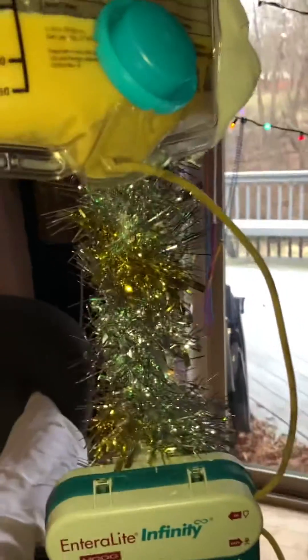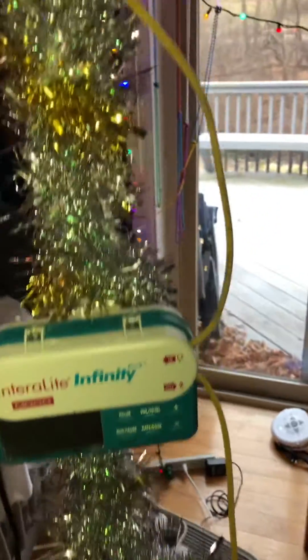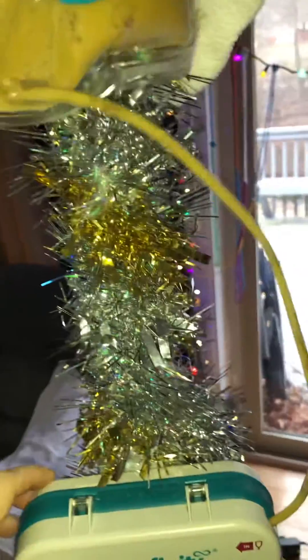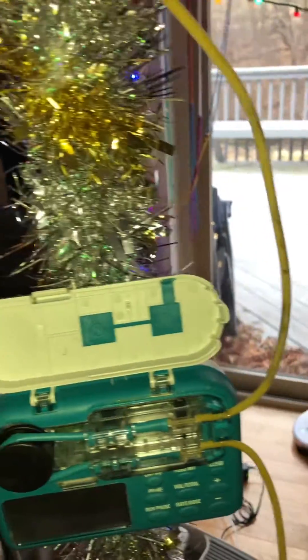We're running Carson's afternoon feed and we just got the same error — no flow in. I smushed the bag, didn't work. I hit prime, it didn't work. I smushed the tubing, it didn't work.